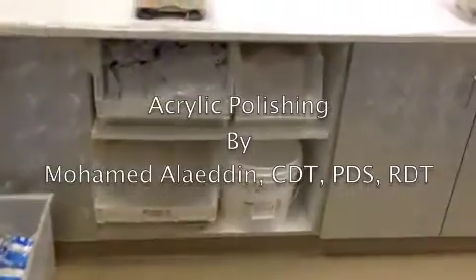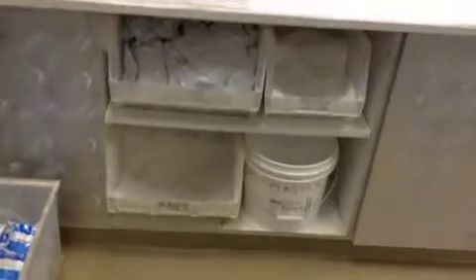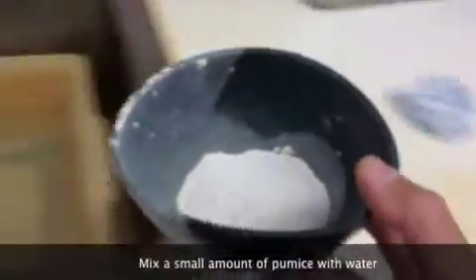In the wet lab by the cabinet, you will find the pumice in a container. You can take just a little bit with your mixing bowl and mix it with a little bit of water.